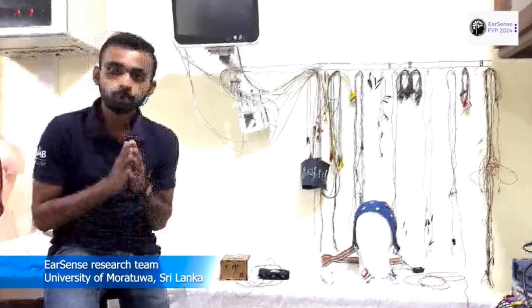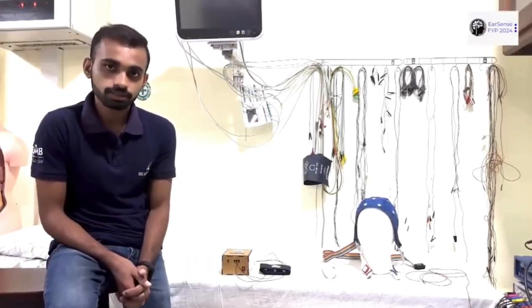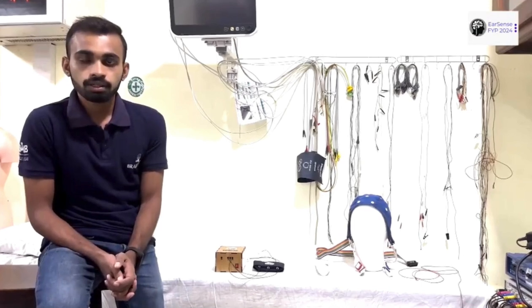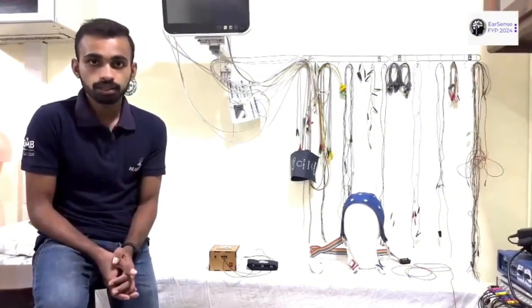Electroencephalography, which is commonly referred to as EEG, is a very important biopotential signal. It tells you about the electrical activity of your brain.